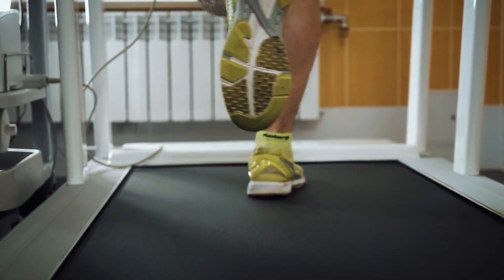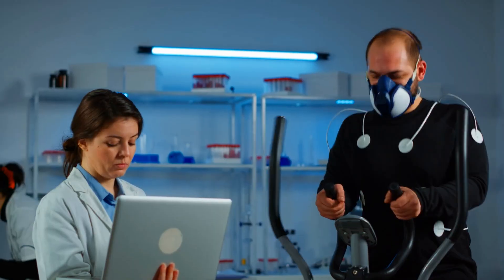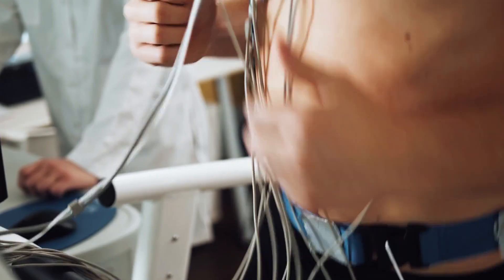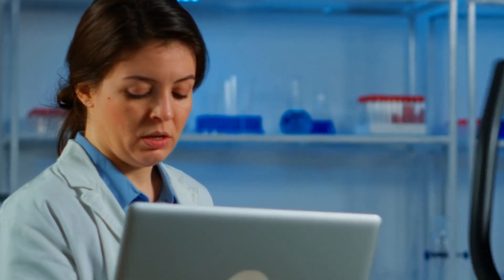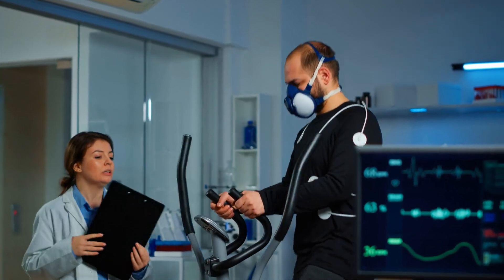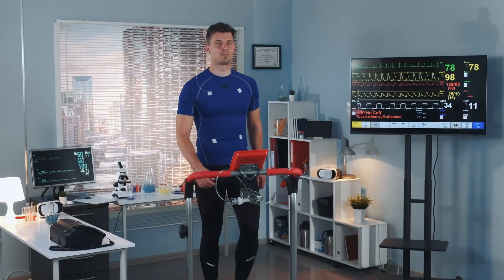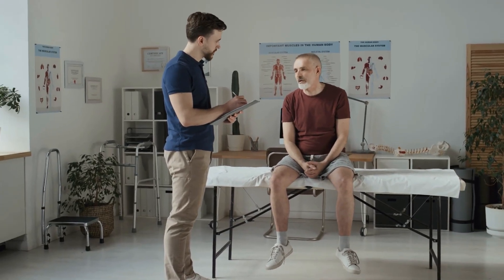We put them on a treadmill or a bike and start at a very low level to figure out where they are and where they're comfortable. There is a prescribed timeframe before we increase the speed and elevation of the treadmill — periodically, almost every one to two minutes, asking the patient how they feel using a scale they can point to. When we see something on the equipment or the patient feels they cannot go anymore, we consider it a complete stress test.